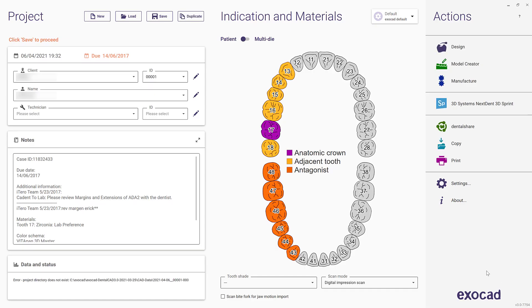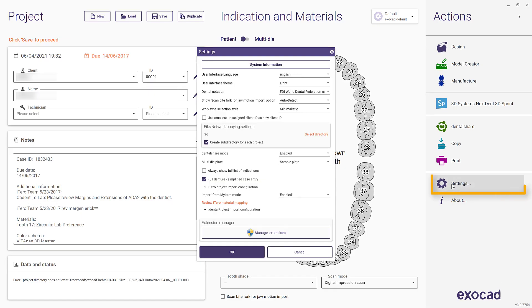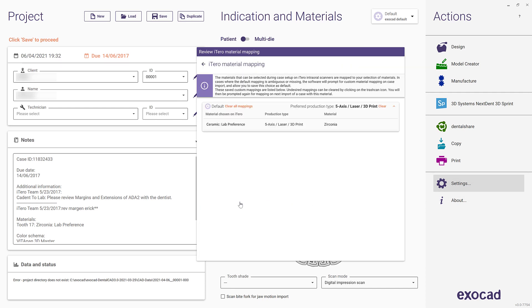If you wish to correct an erroneous material mapping, you can do so by clicking on Settings in the main screen and select Review iTero Material Mapping. In the Review iTero Material Mapping window, undesired mappings can be deleted. Note, after deleting a material mapping, the next time you import a case with the respective material choice, you will be prompted again for your preference.